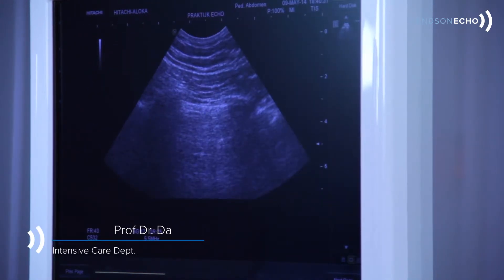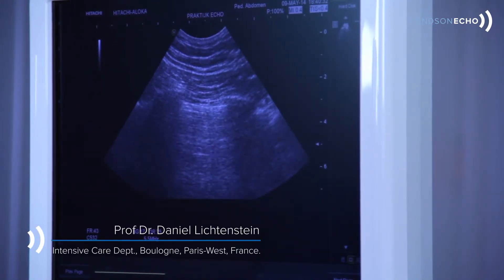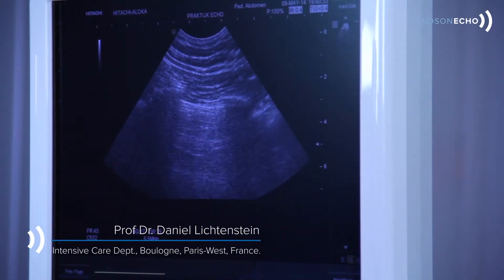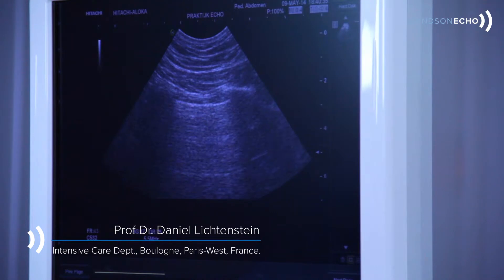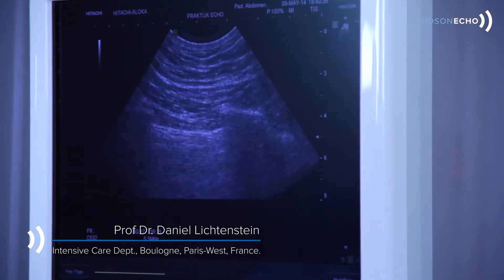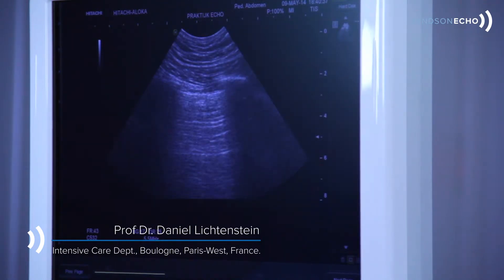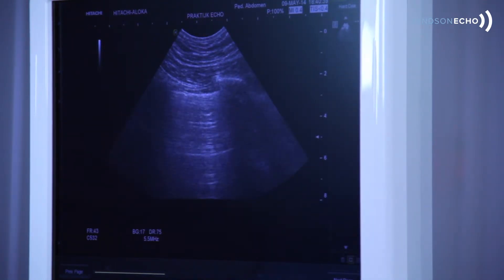Let's go into B mode, let's decrease the field, and here I can freeze the image.